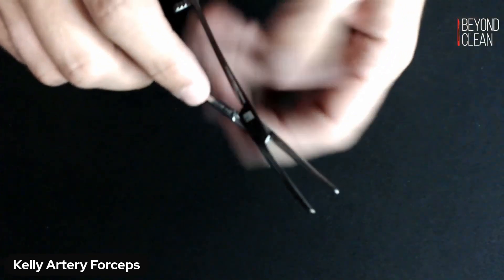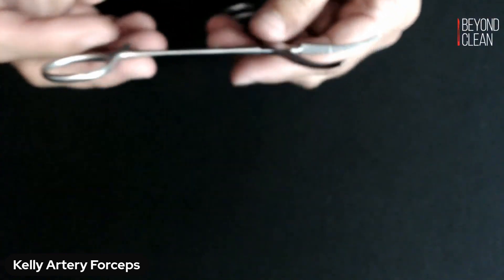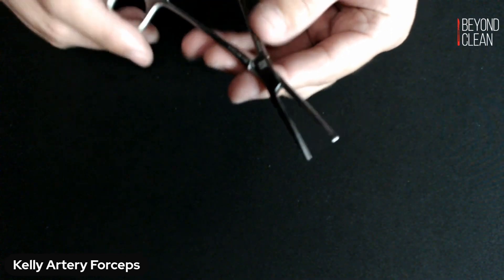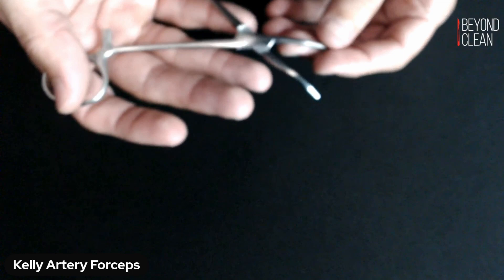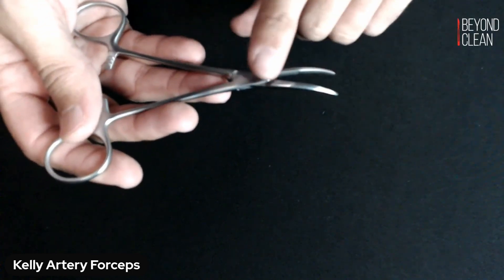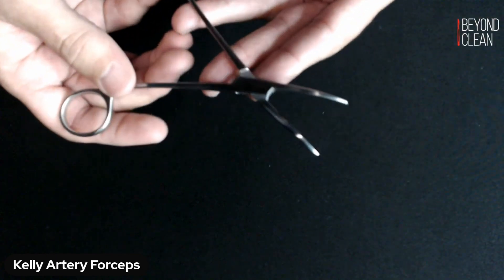Make sure that you've got a smooth action on your clamp. Inspect the box lock on all your hinge instruments for potential cracks in that box lock, because that's where all the tension is coming in. So make sure that you don't have any cracks there.